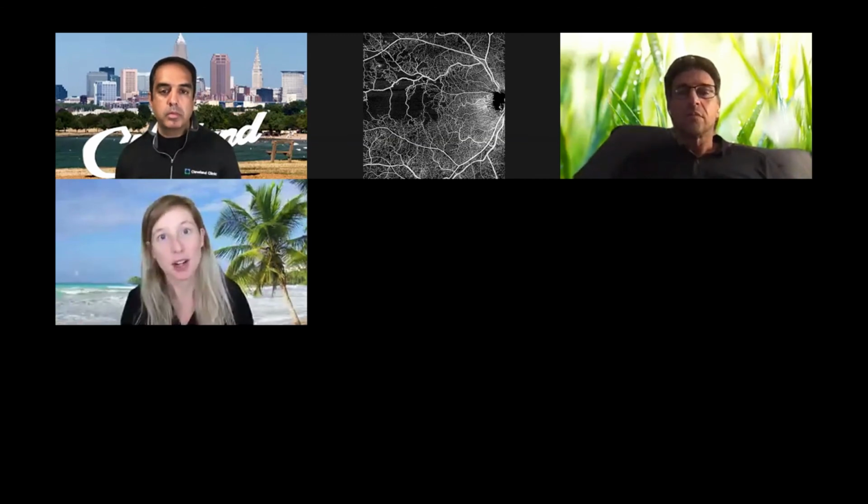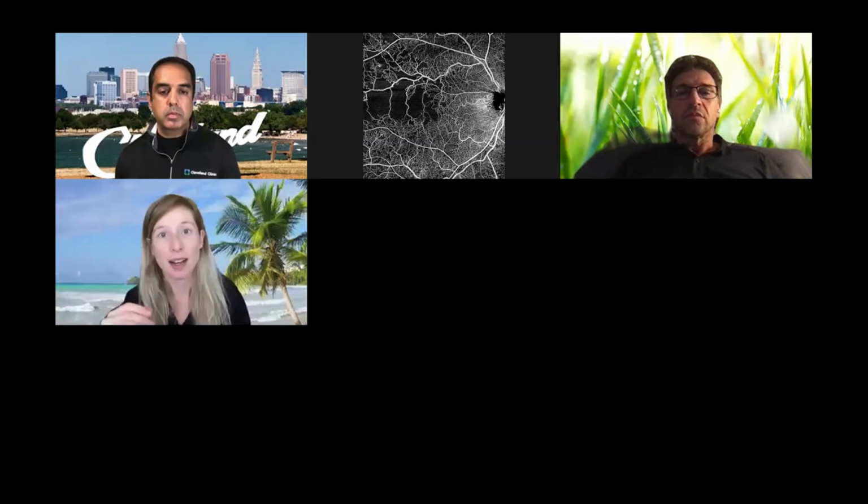So I definitely will use fundus photography and classic fluorescein angiography fairly commonly. Especially when I'm looking at diabetics, you can pick up subtle pathology in the periphery, and I think we're seeing more and more coming out in the trials that conventional fundus photography or angiography is missing some of these peripheral lesions.